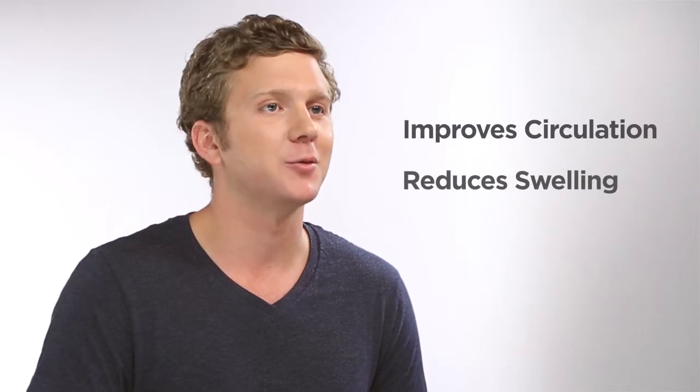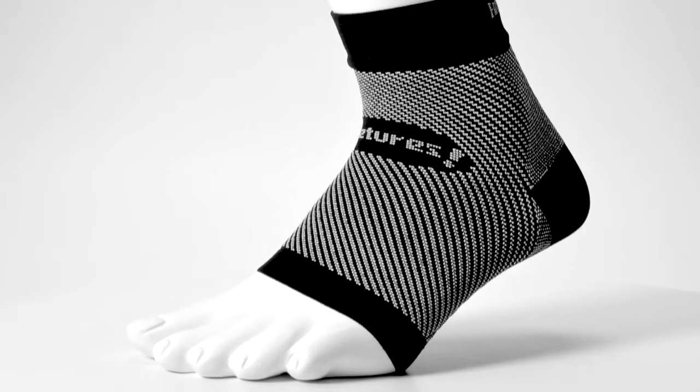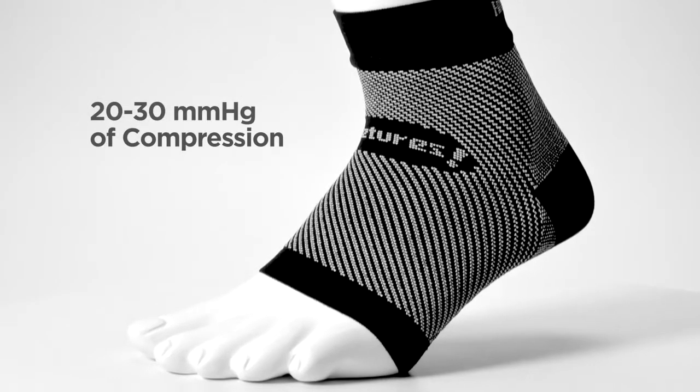Graduated compression improves circulation to reduce swelling and aid in recovery. It features compression of 20 to 30 millimeters of mercury above and below the heel.